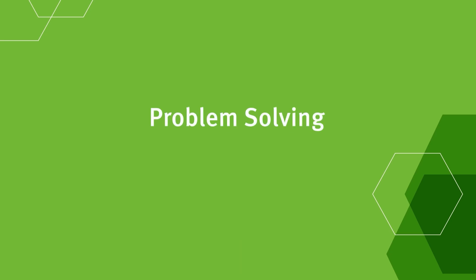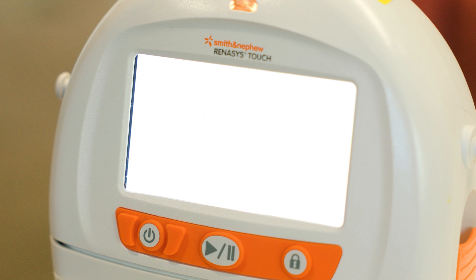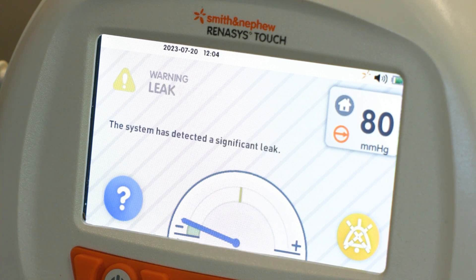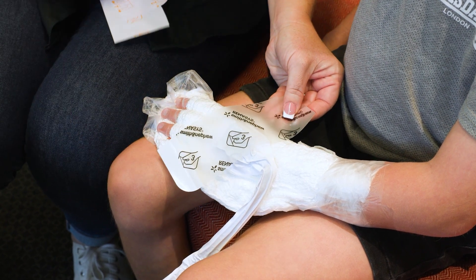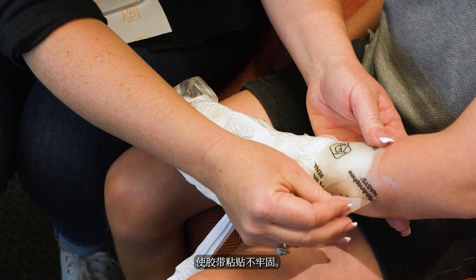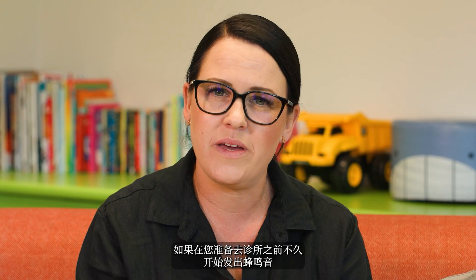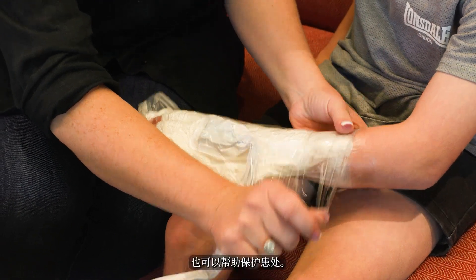If the machine is beeping, the screen will usually say 'warning leak' or 'blockage.' If there is a leak, it means air is escaping somewhere around the dressing. Using the clear tape provided, the first problem area is usually where the tape meets the skin — place the tape over these areas to cover the whole area. Other places can be where fingertips or toes are wriggling and weakening the tape. If you're still having trouble, you're welcome to come to emergency for support. If it starts beeping shortly before you're due at clinic and you've run out of tape, sometimes wrapping the limb in cling wrap can help.